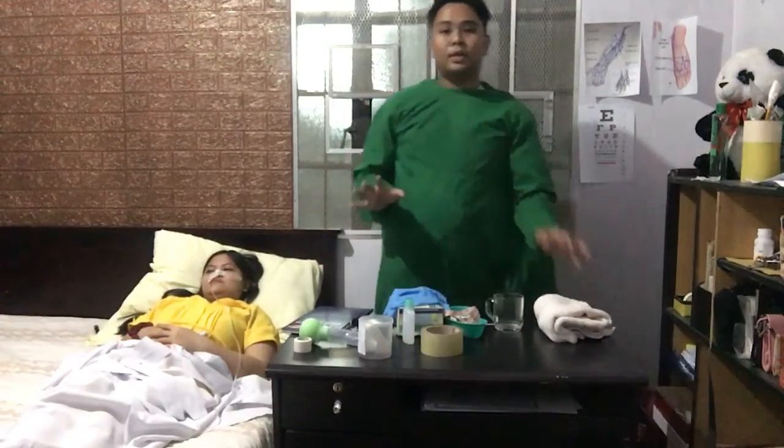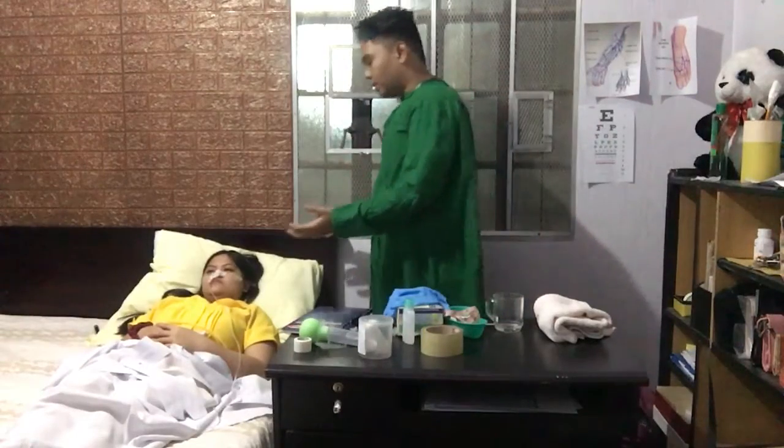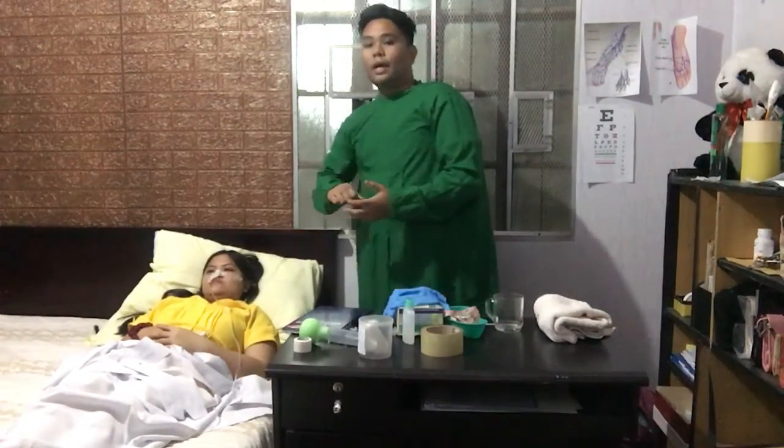Then after po nun, so assemble po natin yung mga equipment na gagamitin natin above the bed table within reach. So ayan po. Then after po nun, so magpo-provide tayo ng privacy sa patient natin. Isasara natin yung door and also the curtain. Then raise natin yung bed to a comfortable height. Working position, usually yung elbow height of the caregiver.